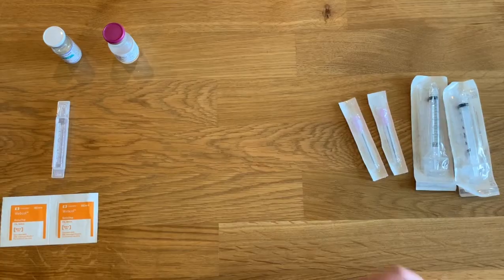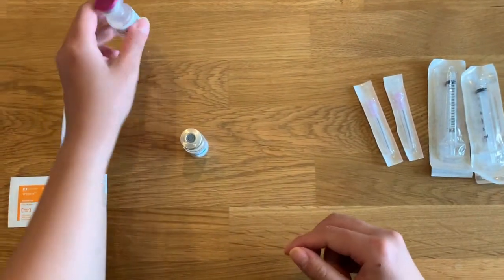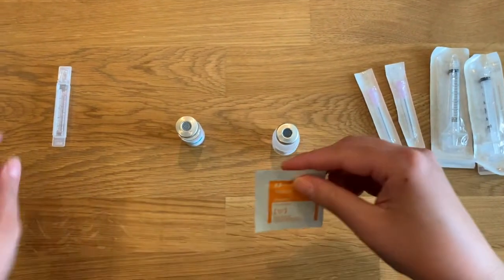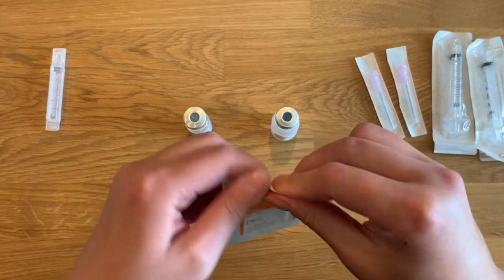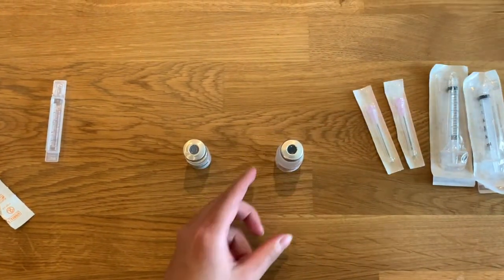The next step is to gather all of your supplies. Once you have your supplies in order, open one alcohol wipe and clean off the top of the colistin vial to ensure that it is sterile. Then repeat this step with a new alcohol wipe and clean the top of the sterile water for injection vial.